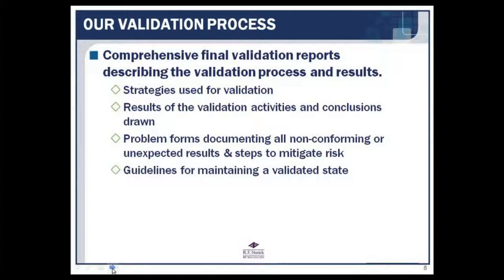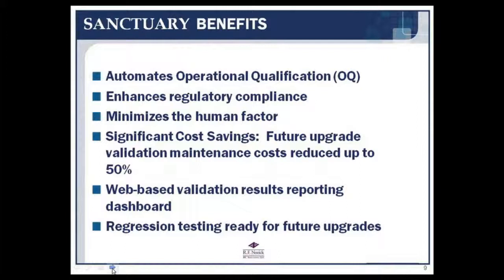We'll also publish a guideline for maintaining the validated state, and we'll publish a guideline for reviewing the documentation that we have stored in the Quality Manager. Next slide.